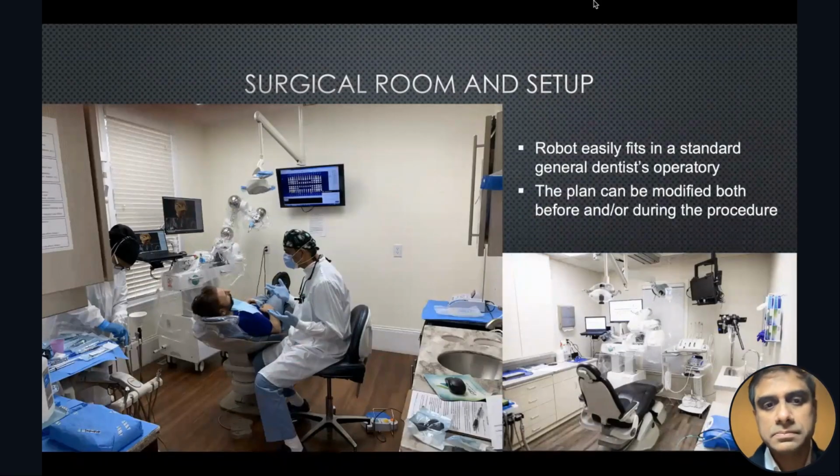Next slide, please. So this is my operatory. You see that it's not a big, humongous machine, because I get these questions a lot, like, "Oh my gosh, this machine looks really big. Is it going to fit into my operatory?" But no, I don't have a huge operatory. I tuck it towards the corner. When I need it, I pull it towards me and my patient.